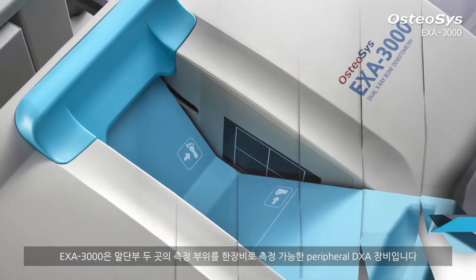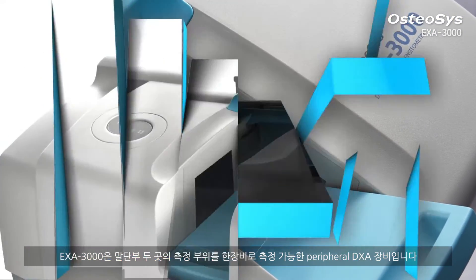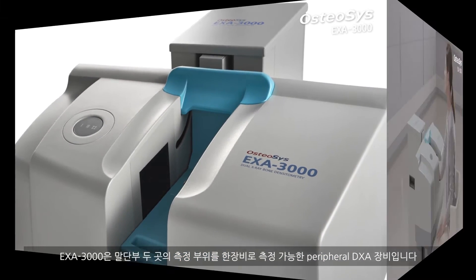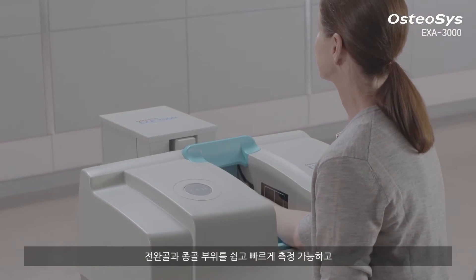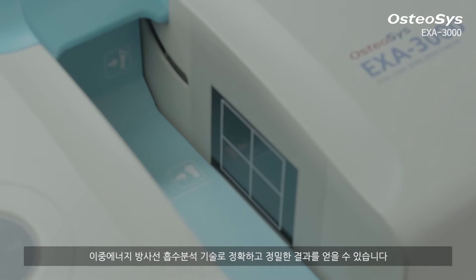Exa3000 is a peripheral dual X-ray absorptiometry device with its multi-site diagnosis function. It is specially designed for easy and swift scanning of the forearm and calcaneus. We guarantee a precise result with DEXA technology.